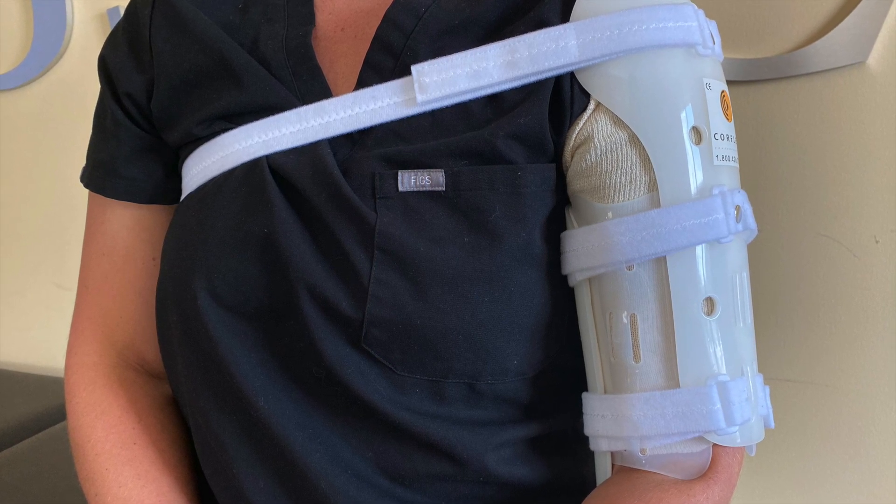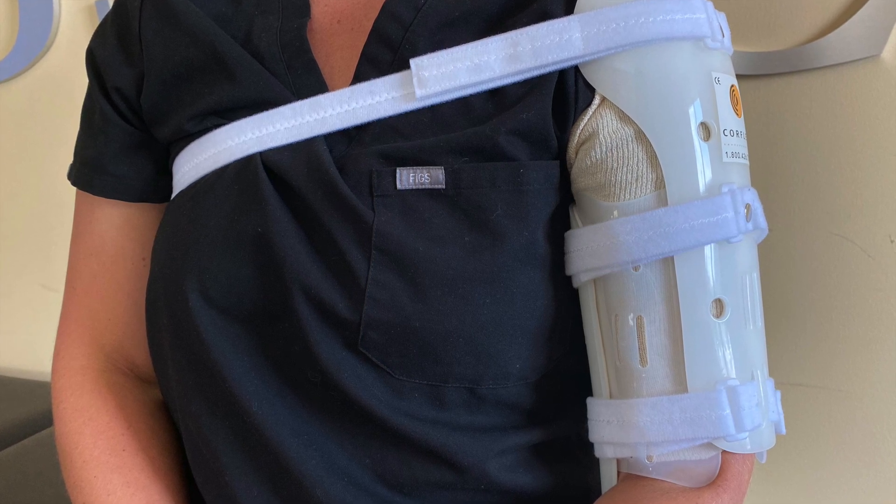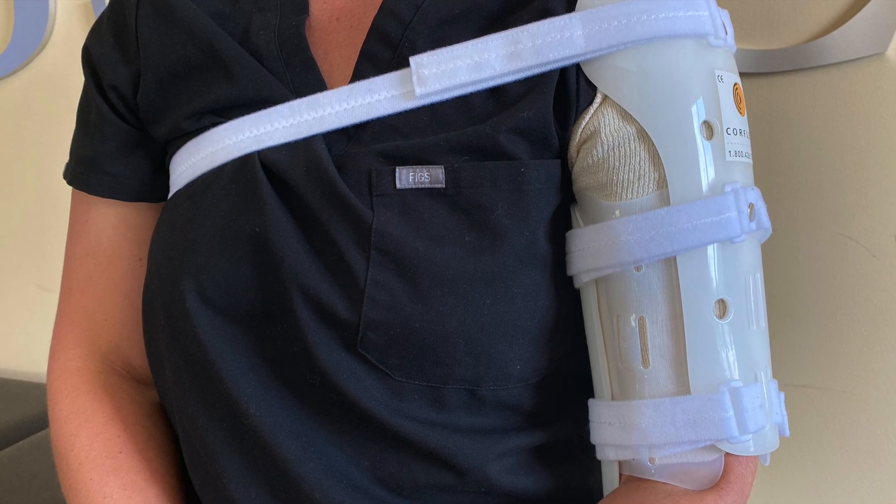Each time you remove your splint, please check your skin for any areas of irritation, and before reapplying, apply a new stockinette.